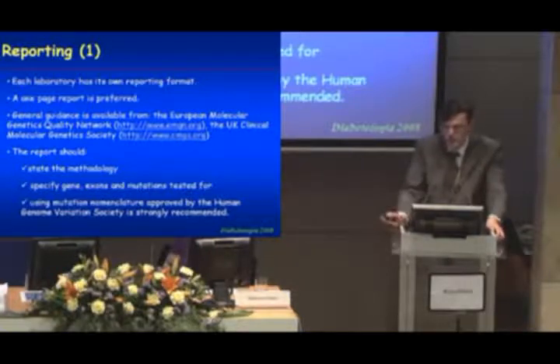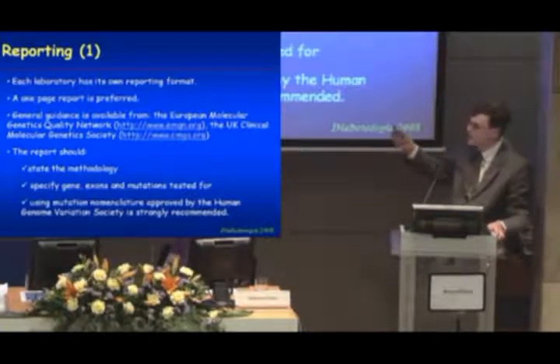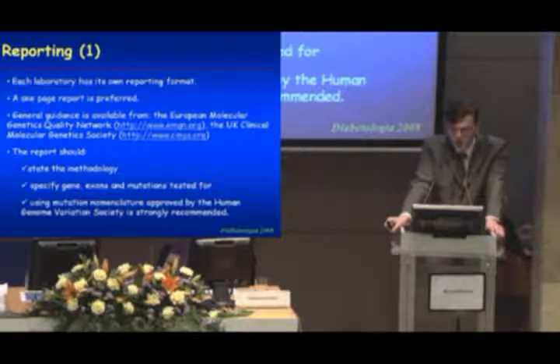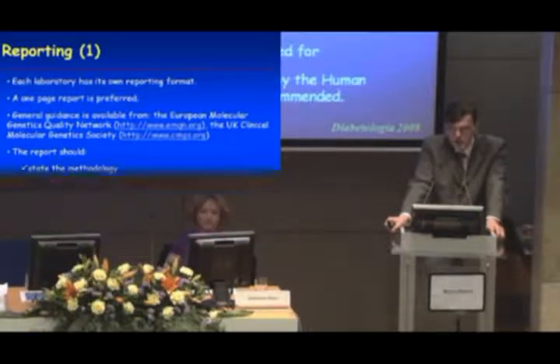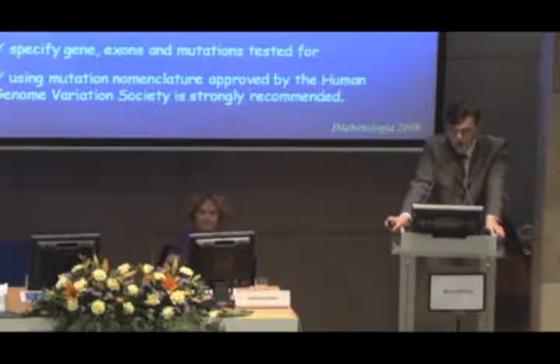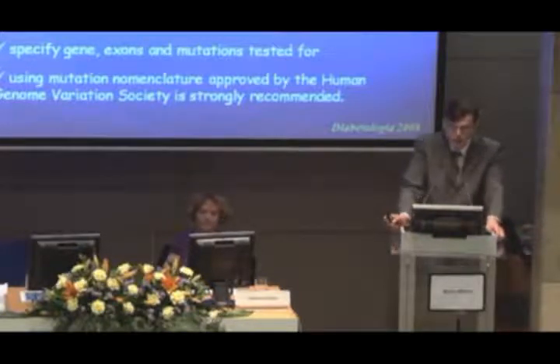There are some general guidelines available, and you see the website addresses as shown here on this slide. The report should state the methodology, specify the gene, exons, and mutations tested for, and we should be using mutation nomenclature approved by the Human Genome Variation Society.